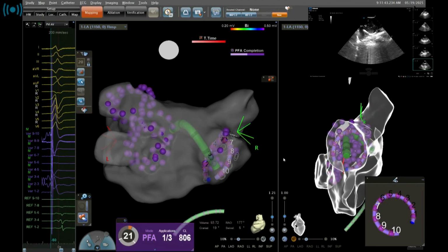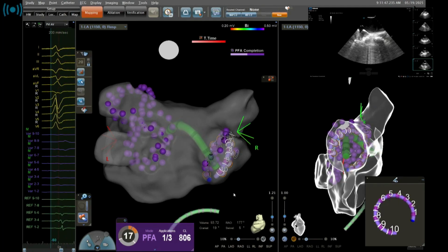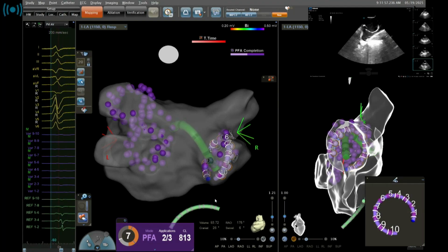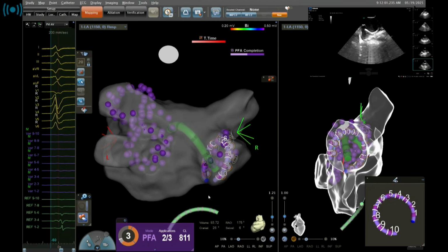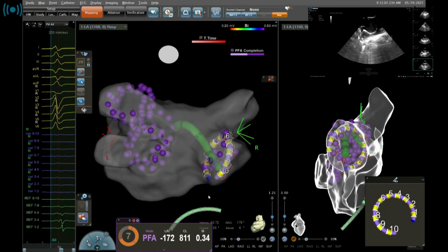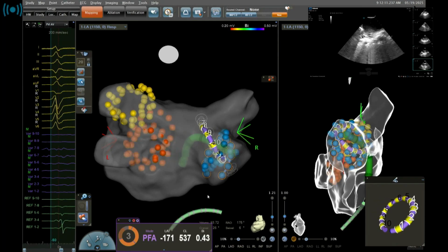I changed the 110 position and give it the last one here. Massimo, I was interested to hear you can only clock the catheter. I have no experience with this. Have you ever counterclocked it accidentally? What happens? If you are in the left atrium, nothing. If you are in the appendage or close to the valve, you go like a screw, because this catheter you can only rotate clockwise.